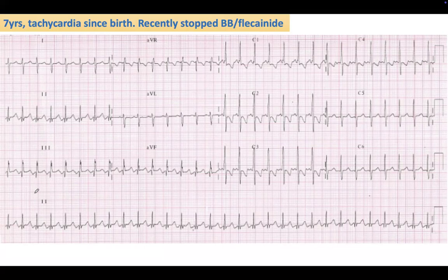But the question is, first of all, tachycardia, narrow complex or wide complex? Looks narrow. Narrow complex, regular. So I would say regular, narrow complex tachycardia. The next question would be, is it sinus tachycardia or is it something else? So Smile is saying sinus tachycardia. Everyone else, are you in agreement or disagreement? Some P waves not clear.